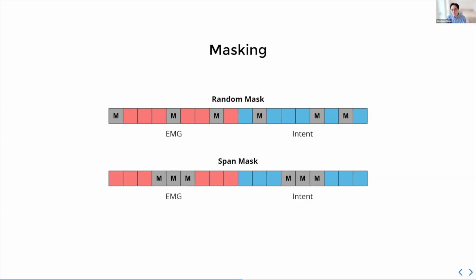And intent is the same thing. I'm very unlikely to open and close my hand 200 times per second. So if you have the immediate before and after, it's easy to infer the intent. So if we train it with random masks, it doesn't really help with learning a strong feature space. So therefore, we go with the span masking approach, which is also very common in language models. And this just helps us to get a better representation space.